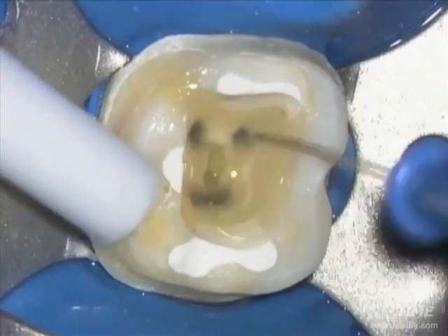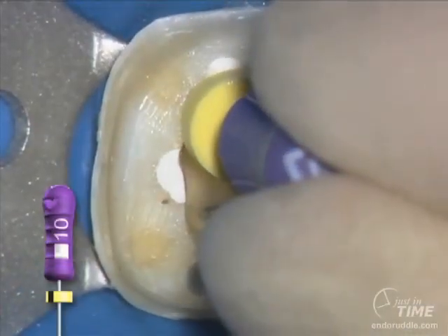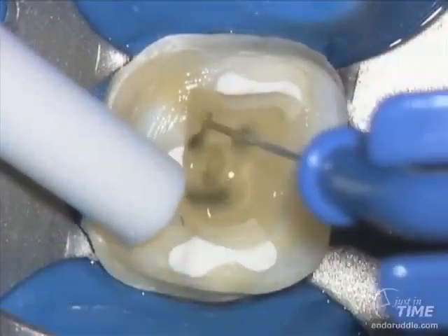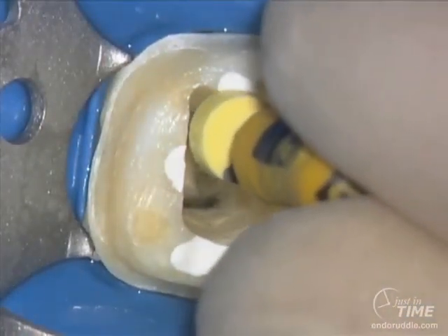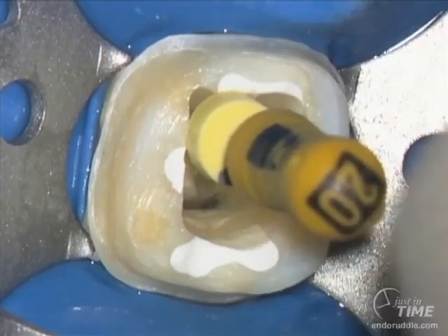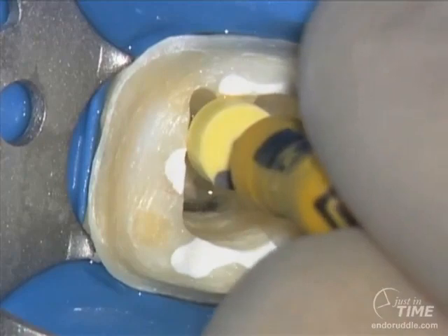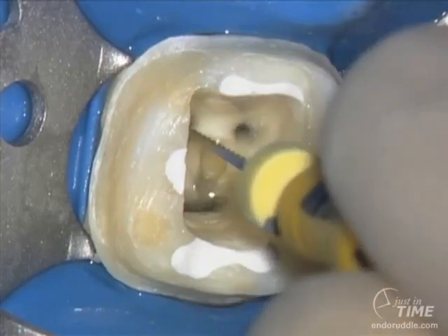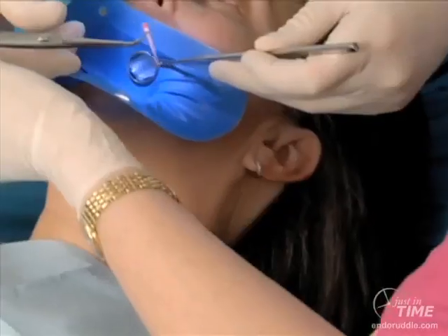It's always good to know you have a smooth, reproducible glide path and that the terminus is patent. Here I am gauging with a 2002 hand file. If the file is snug at length, my shape is done. I like to fit the cone exactly at this moment because I have the preparation objectives clearly in my mind. I'm using a matching ProTaper cone.